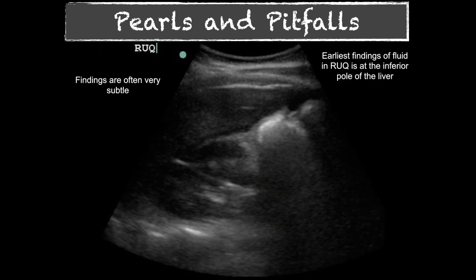Findings are often very subtle. This image here is positive for free fluid. The fluid has accumulated at the inferior pole of the liver, which is one of the more sensitive areas initially. As fluid comes up from the pelvis or crosses from the spleen while the patient is supine, it typically collects at the inferior pole of the liver or kidney — whichever is most inferior — also referred to as the paracolic gutter. Eventually it spreads upward between the kidney and the liver.